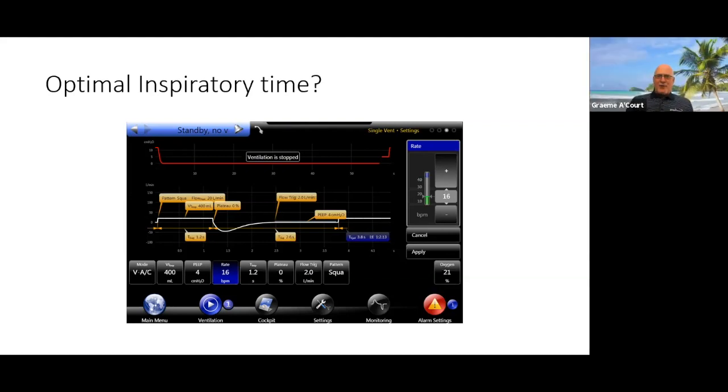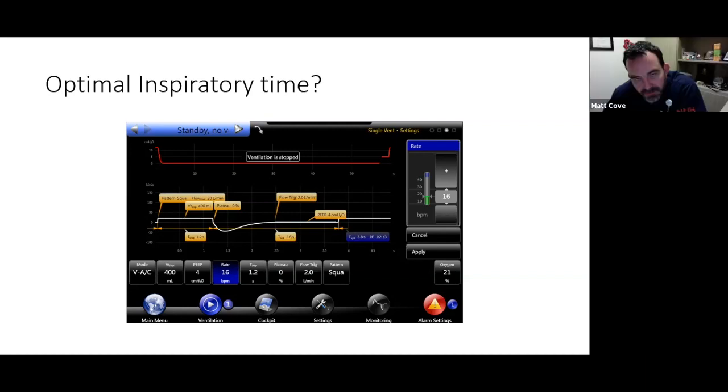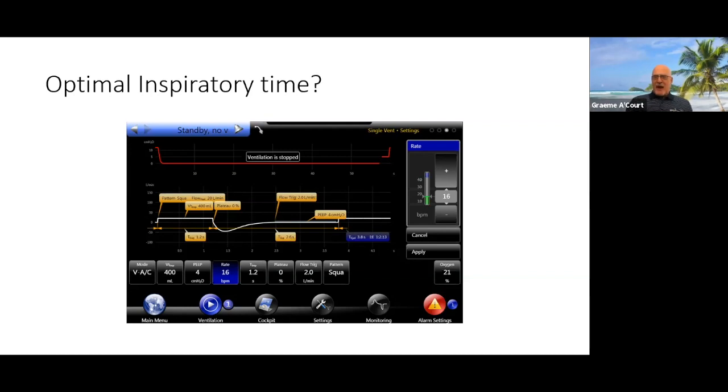So my bias is not volume ventilation, right? But over time, we're going to cover modes. And you'd be quite surprised around the world how many people still use volume AC. It's probably the most commonly used mode because people like numbers, right? And when you see it being used, you think about it: do they actually adjust the ventilator, or do they just believe that the tidal volume is enough? And you sort of see a lot of what I call desynchronous ventilation, because the ventilator is not being adjusted, it's just being set on a volume.